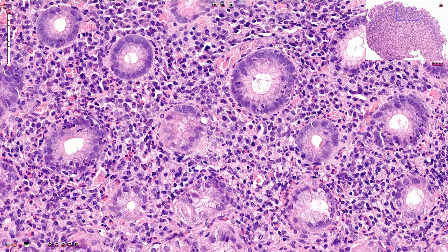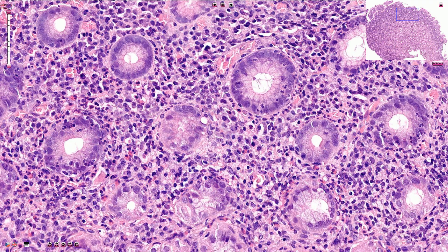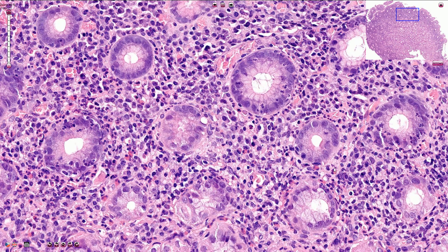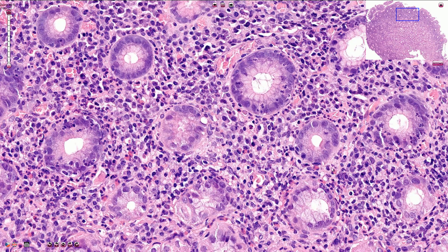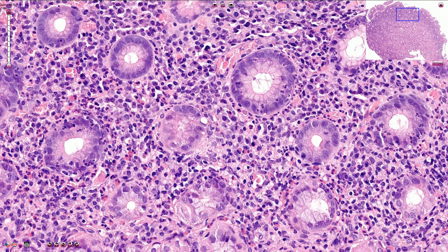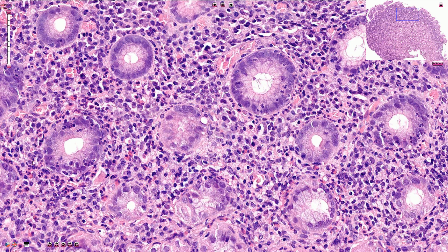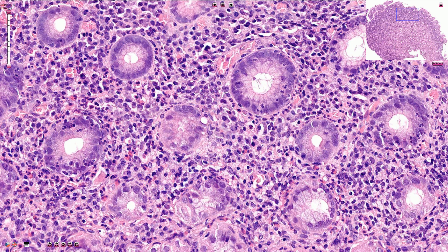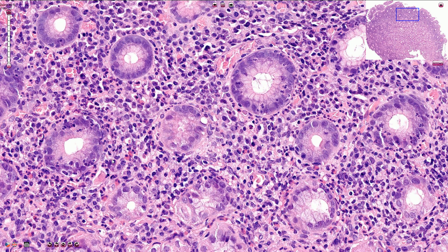Here we even have some eosinophils with eosinophilic granules in the cytoplasm. In some cases where neutrophils are quite sparse, we can usually find them in the area of the neck of the foveoli, like here.